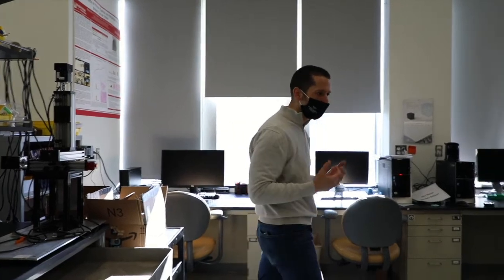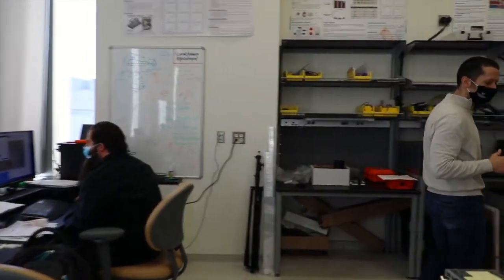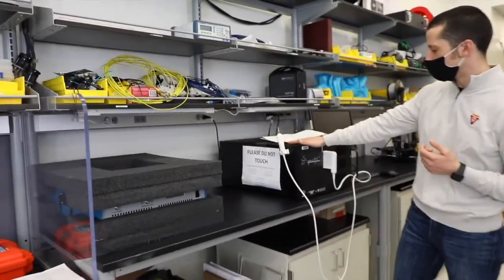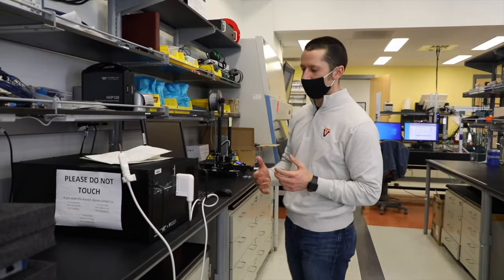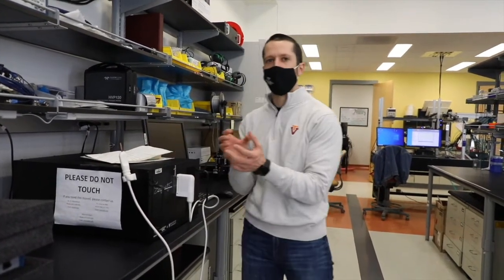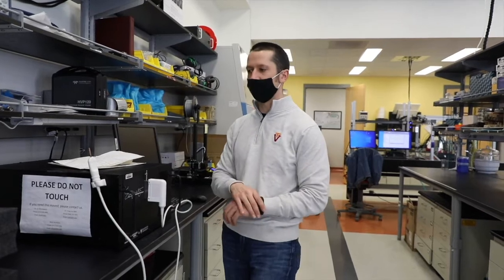So if I walk through the rest of the lab, it's going to be very similar. You're going to see a lot of device work, setups. This is a high-frequency ultrasound imaging system that was built by a company called Daxonics and a collaborator of ours in Halifax, Nova Scotia. We work very closely with Dr. Jeremy Brown, custom developed this, and now we're building, in partnership with him, these endoscopic histotripsy systems that utilize his technology for this high-frequency imaging.